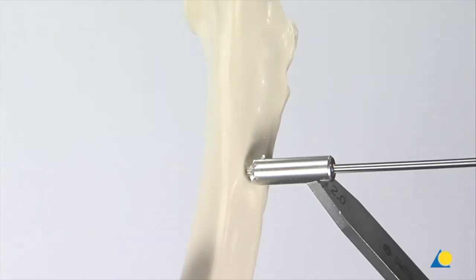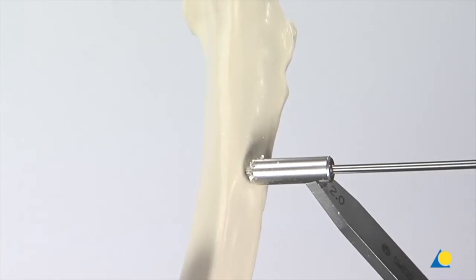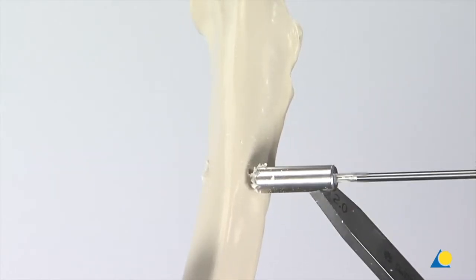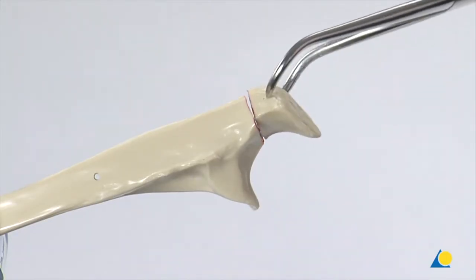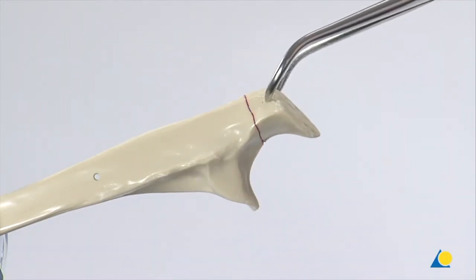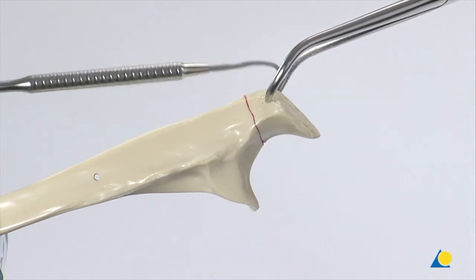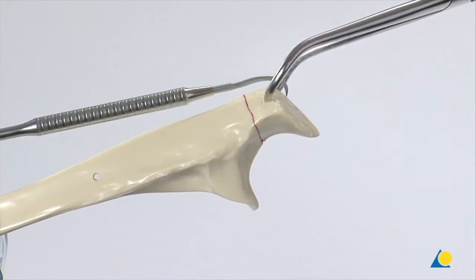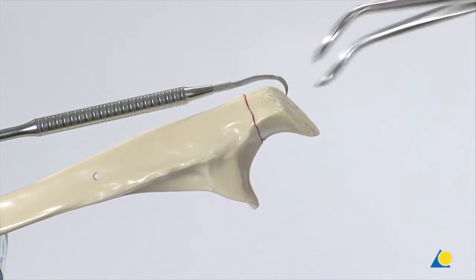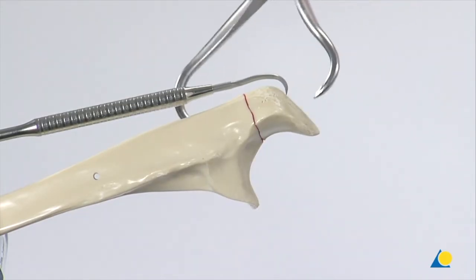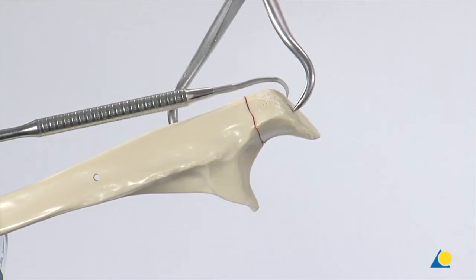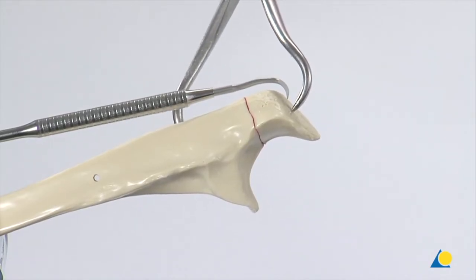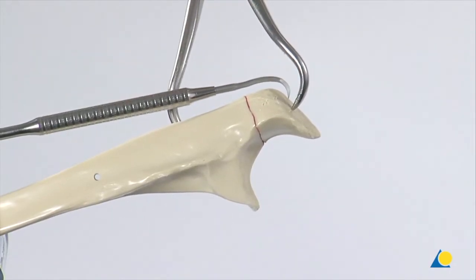The fracture is reduced with the large pointed reduction forceps. The fragment is held in the reduced position using the sharp hook. The forceps is then applied to the reduced fracture, making sure not to block the later insertion site of the K-wires. The hook is now removed.